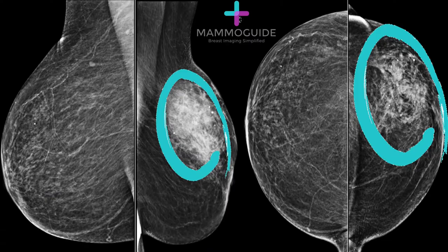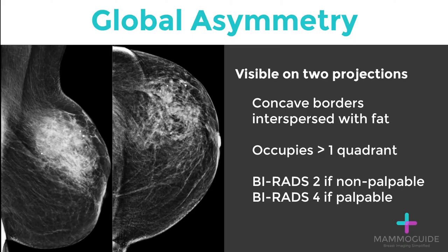A standard screening mammogram demonstrates a global asymmetry in the upper outer quadrant of the left breast. Global asymmetries are visible on two projections and have concave borders interspersed with fat. The difference between a global asymmetry and a focal asymmetry is that a global asymmetry occupies more than one quadrant. Global asymmetries are often due to normal anatomic variation. If they are non-palpable, this can safely be given a BI-RADS category 2. However, if it is a palpable abnormality, further evaluation with ultrasound and likely a biopsy is recommended.